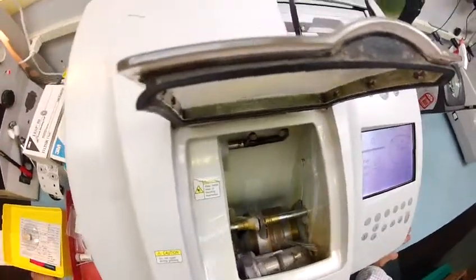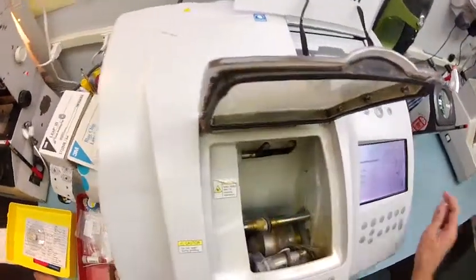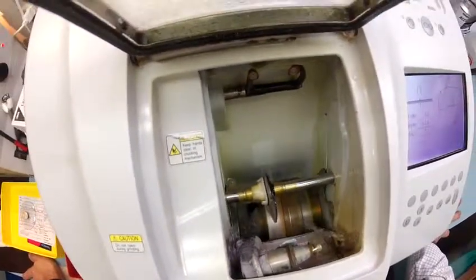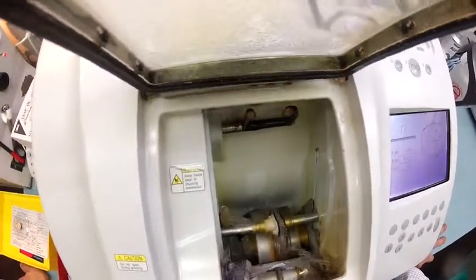We see your lens as it starts to take shape. This is the outer temporal area. This is going to be at the nose. If you notice, your lens is completely flat, like a nickel. If I were to take it out, it would stand up on its own. Now it's going over to the bevel wheel, and it's going to put the bevel onto the lens so it stays inside the frame.